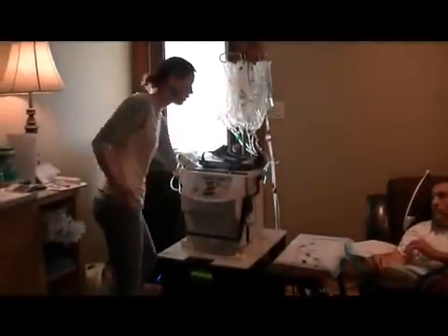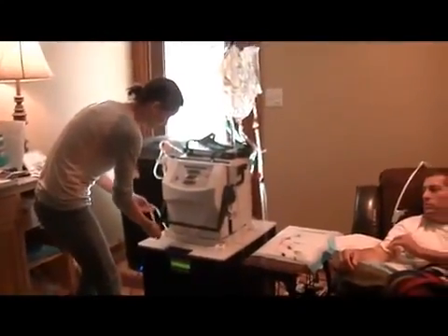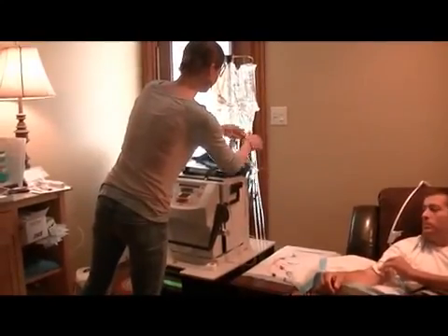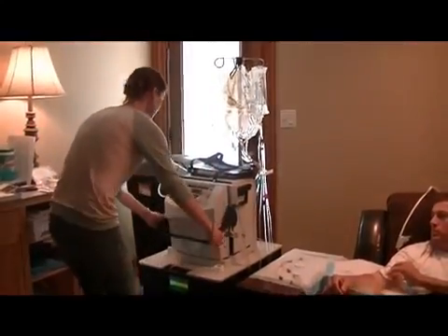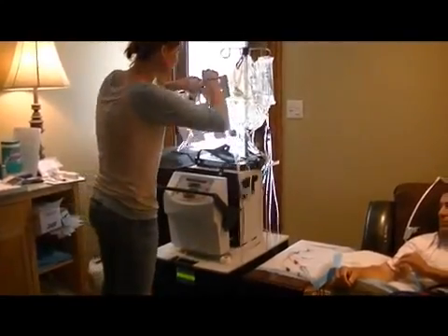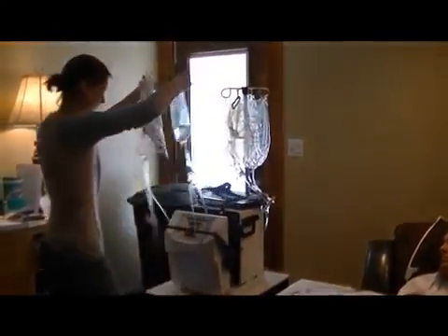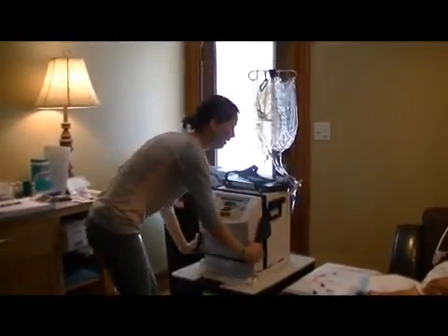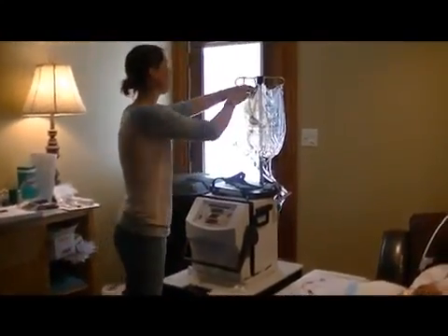To tear the machine down, you just turn it off, and you basically undo everything that you put together at the beginning. The line goes back up to the bag. Unhook. Sometimes they're hard to do. And you just open it. The cartridge and everything comes out. You use a different one every time. So this is trash. And that. That is basically it. We put the needles in the sharps container and we just use disinfectant wipes and clean everything off. This all goes in the trash as well.